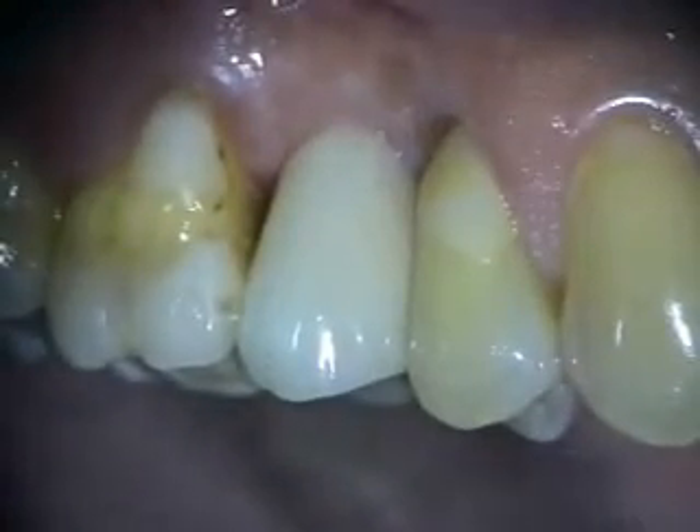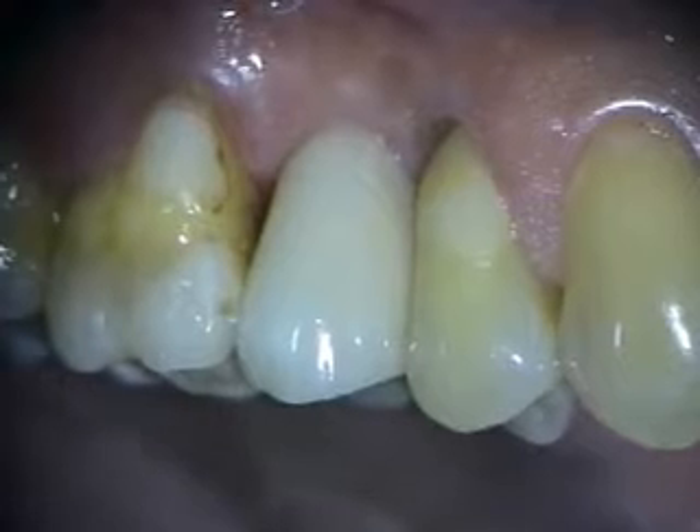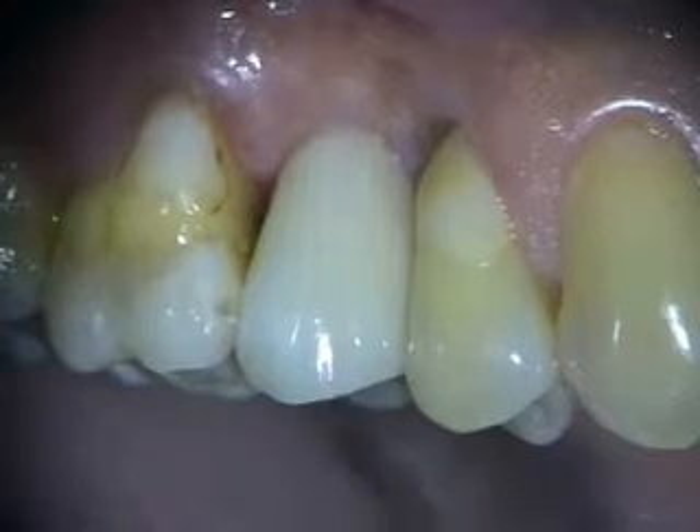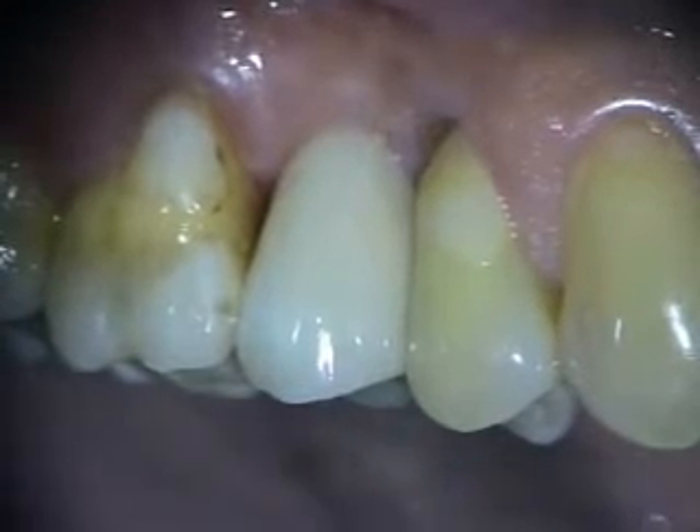This is the restoration on the implant that was replaced in the number four area, and this is a just over two-year follow-up. We'll take a look at the x-ray next.